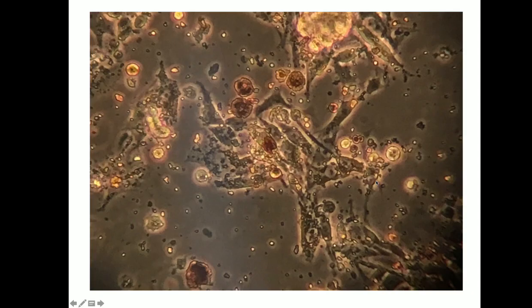And the surplus tumour cells can actually be used for in vitro assays, for single cell sequencing. Disadvantages: you do need fresh tissue and you do need a fair bit of it. And it's also not a mutational test. It doesn't tell you the sequence of the genes. So this is what Robin would grow up in culture before she goes and does the test, and this actually makes sure she dissociates the tumour cells and makes sure there's no lymphocytes, macrophages, stromal cells, and she's just getting pure tumour DNA, and there's often excess tissue after we did the SNP test.